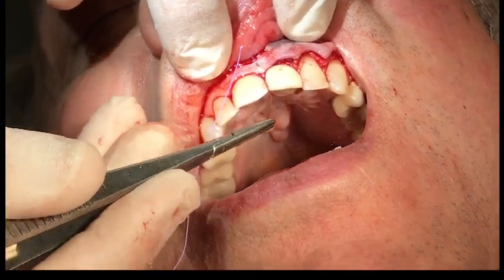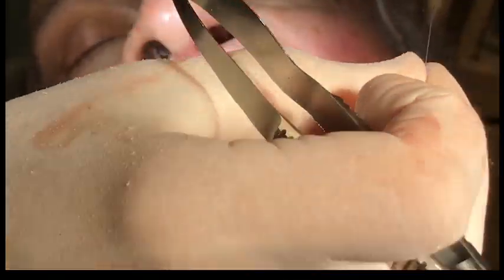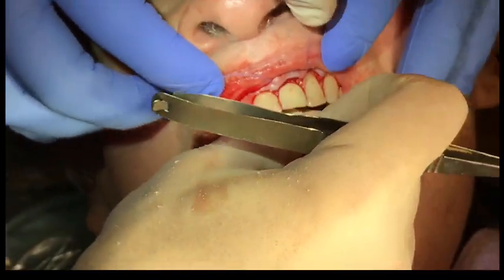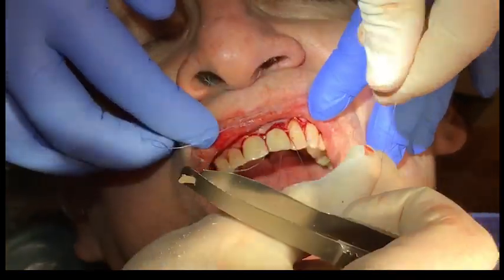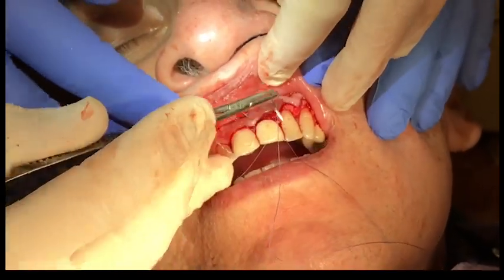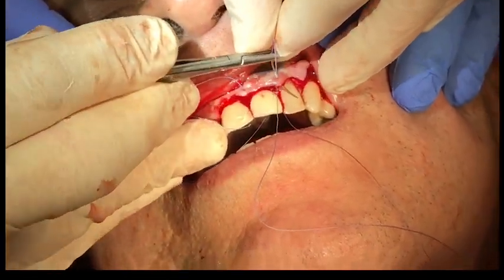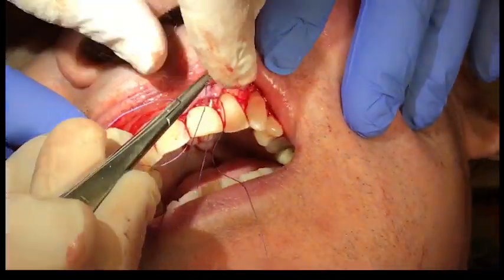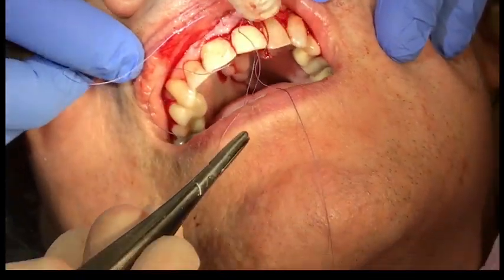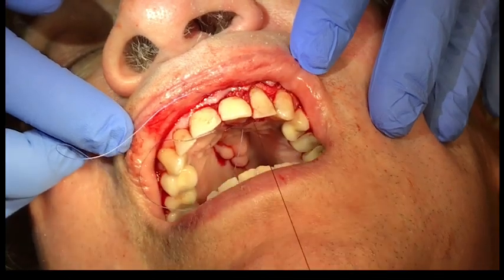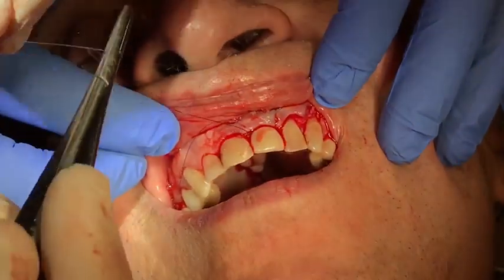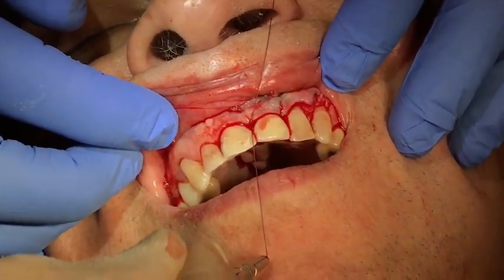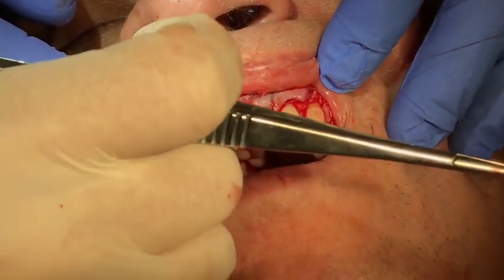4-0 Vicryl was used to reposition the tissue, first starting with a sling suture that would allow the coronal positioning of the gingival tissue. It is important to remember that when using a sling suture, the only puncture that is performed is through the buccal or facial tissue on either side of the tooth in question. There is no penetration of the palatal tissue. The suture is tied off and when this occurs, the gingival tissue is in the appropriate coronal position.